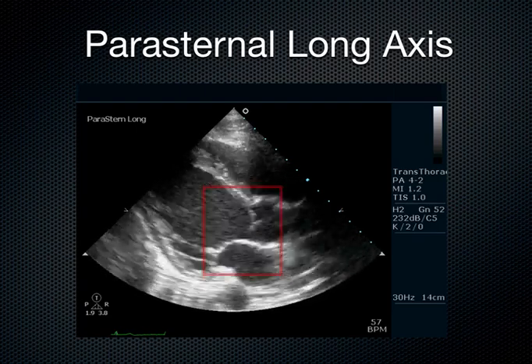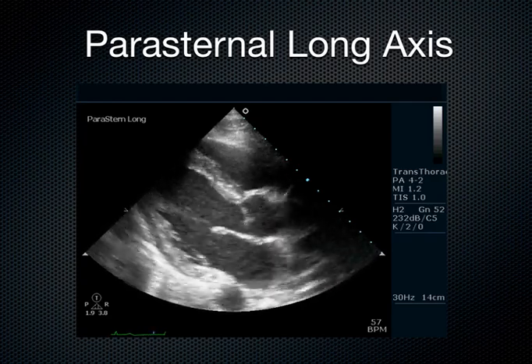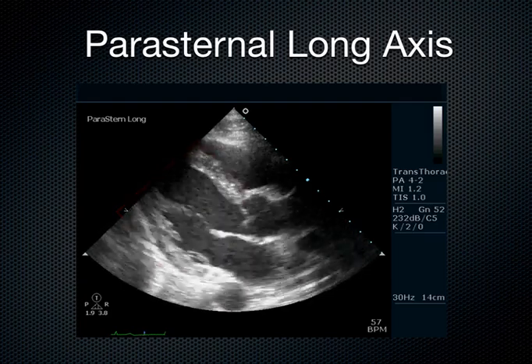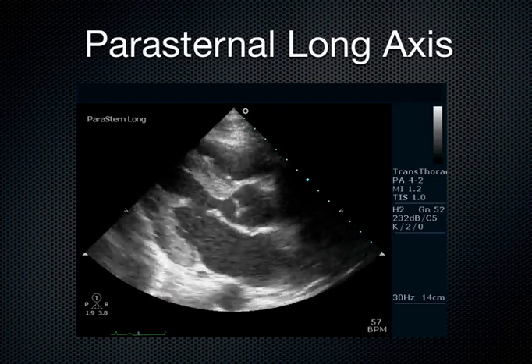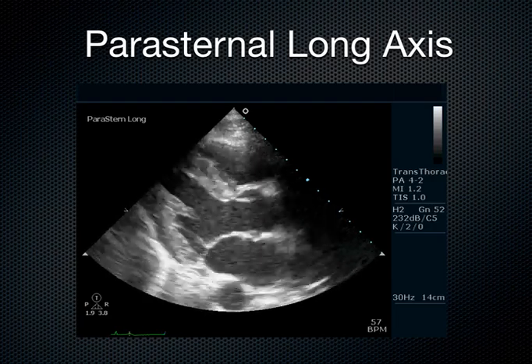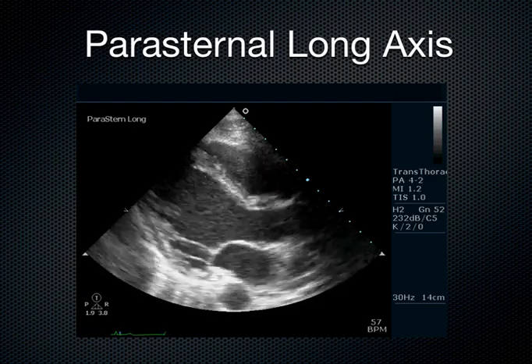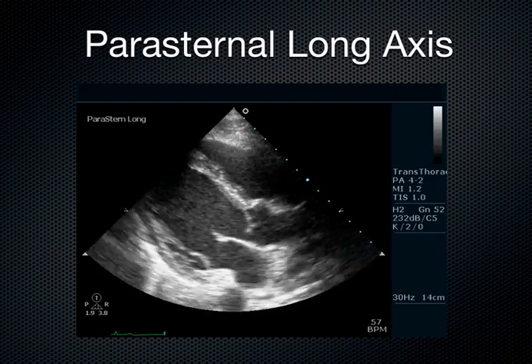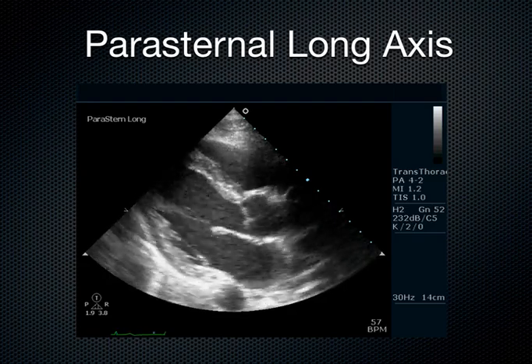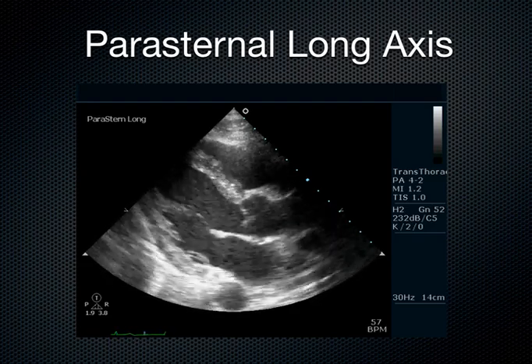So again, I look at the anterior septal leaflet of the mitral valve, and I go ahead and look at the posterior wall and the interventricular septum and how well they squeeze towards one another. And clinically, the way I would use this is, let's say this patient had low blood pressure, and I'm trying to decide what to do next. And generally speaking, I can give more fluids to try to get the patient back up on that Starling curve. Or occasionally, the heart doesn't beat strong enough, so I have to be very careful with fluids.